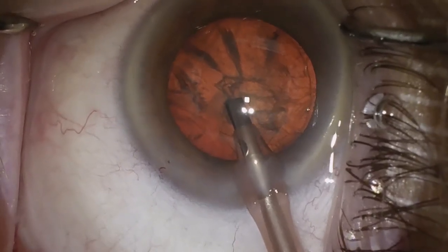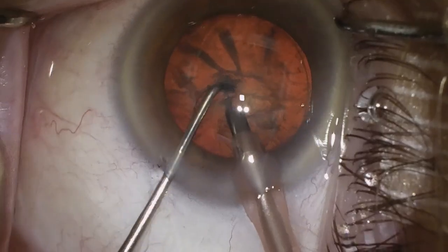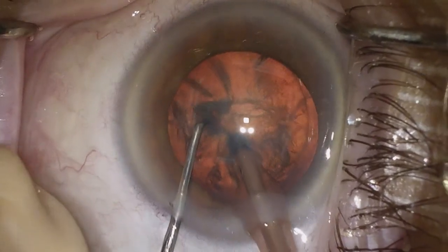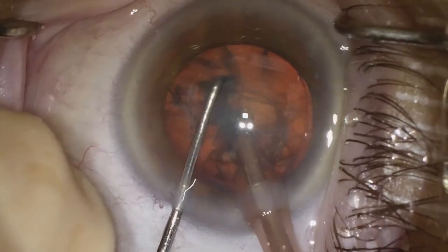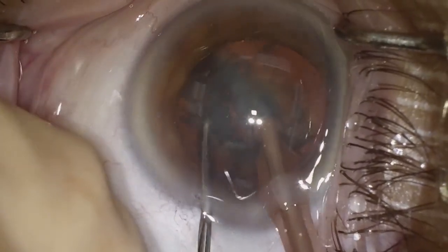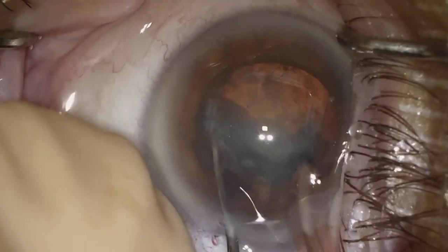So, in essence, for this patient with lattice corneal dystrophy, the surgery is really not any different from what I would do before. Although the view does look quite good here with the microscope, there was some difficulty visualizing the details intraoperatively, but thankfully things have gone well with this case. And the patient has also done well.